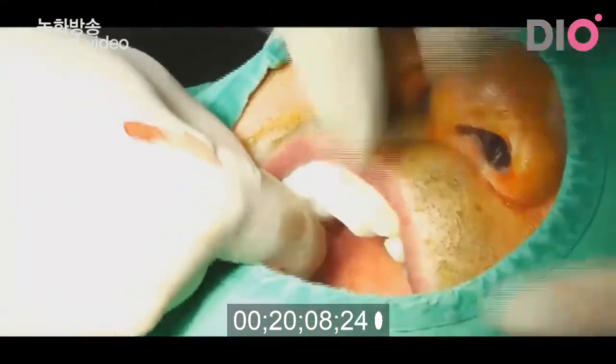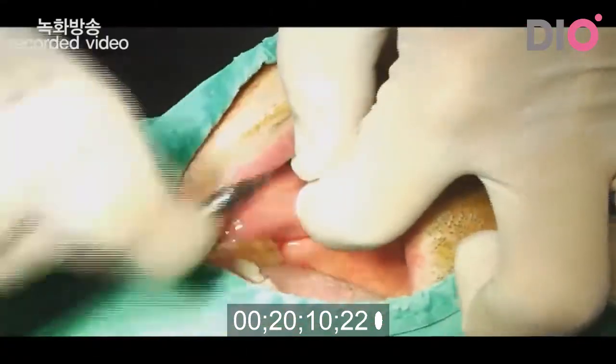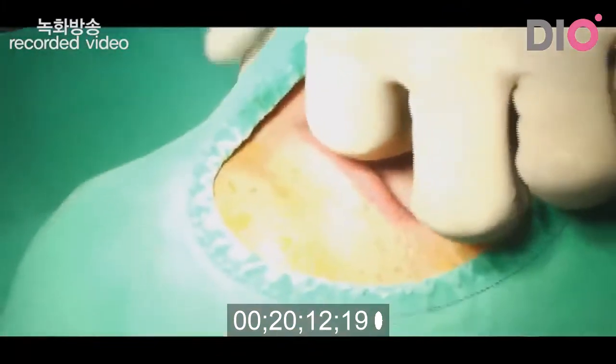Crown remove. Okay. This. I removed the connector, and the second implant.